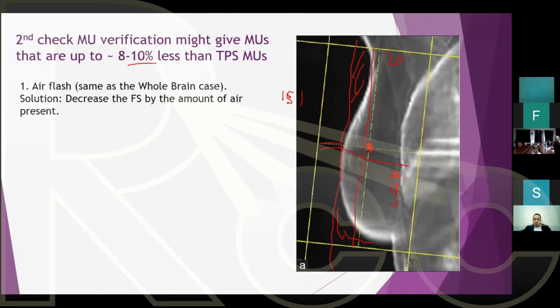So we're trying to remove air. We're trying to tell the Excel sheet that there is air there, okay? So either use percentage of block for the entire field, or close the x-axis from this side and then estimate how much block you have here, just like we did with the brain.